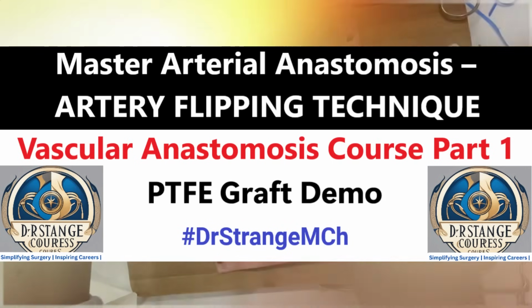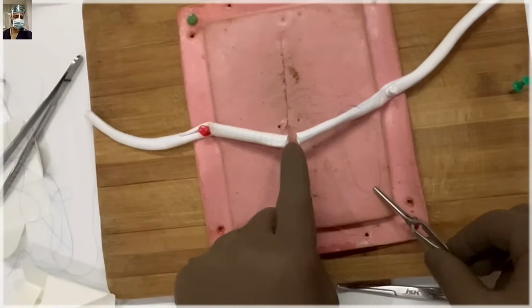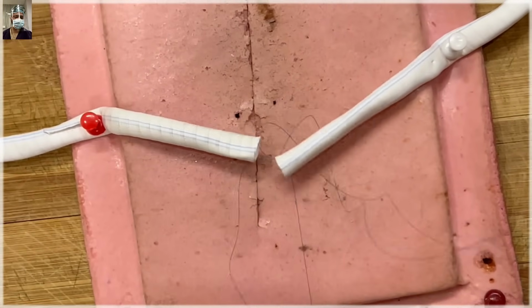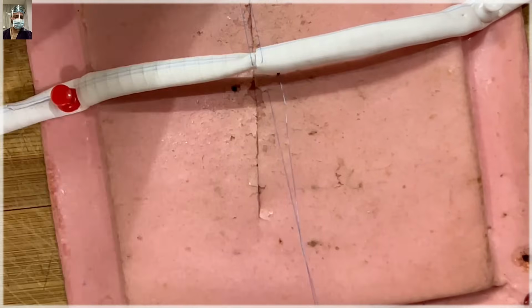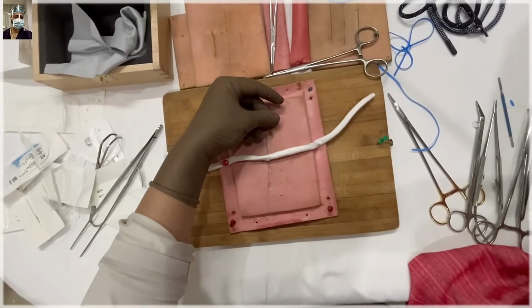The blue line is, as you can assume, this is marking. So now we are bringing the farther end, that is the 12 o'clock suture, beneath the arterial wall. So it rotates this way, and you can easily see: the 6 o'clock goes to 12 o'clock, 12 o'clock goes to the 6 o'clock, and the posterior wall of the artery is basically exposed.